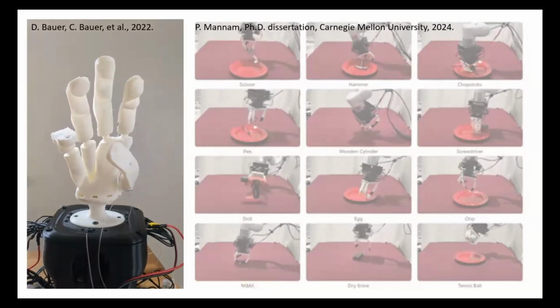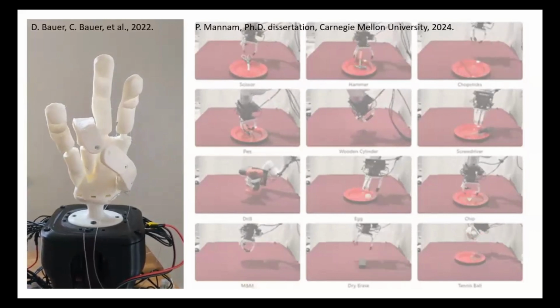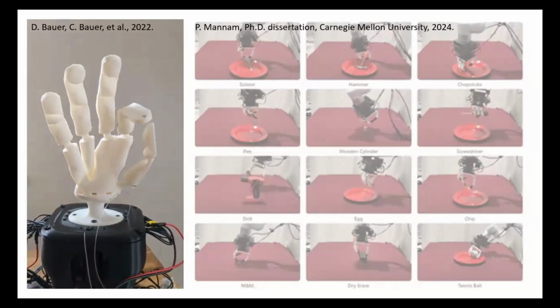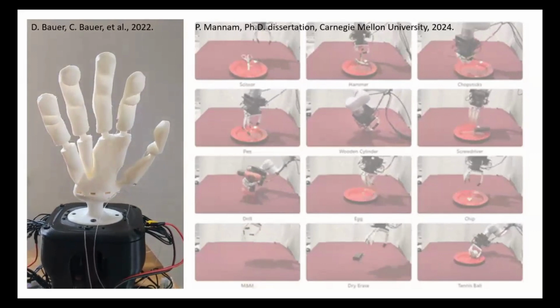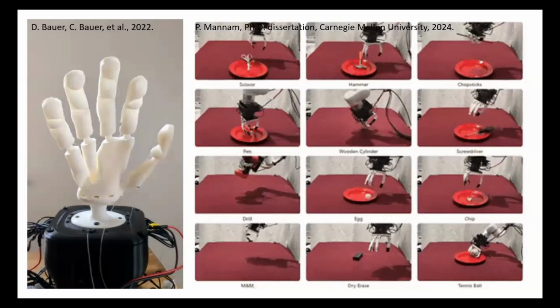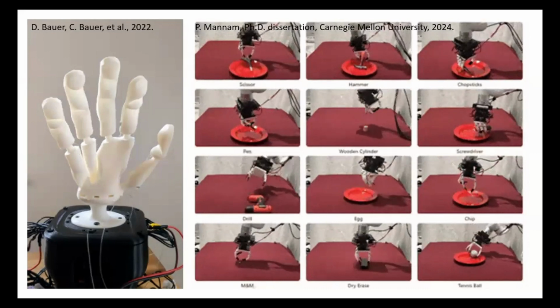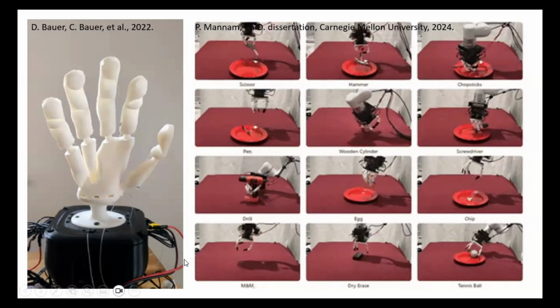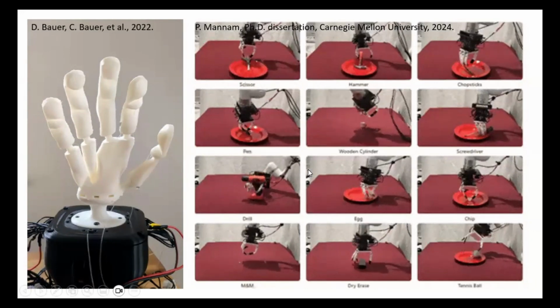And it's capable of doing these simple dexterous motions of just touching each fingertip. A lot of it is because we have dexterity offered from these different tendons that allow these different movements that are very human-like. And also from previous soft hands that we've developed, you can see the varieties of objects that we're able to grasp, from thinner objects like a chip or an M&M, versus heavier, bigger objects like a drill.